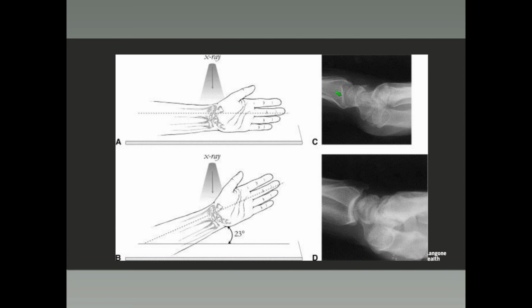Here's a good lateral x-ray, okay? But what you cannot see is down the joint line. Here, the ulna is obscuring the radial joint line. Not only that, remember, there is a 20-degree inclination to the radius. In order for us to see down the radius, down the joint, we have to lift the ulna and the radius about 20 degrees. Now we can very clearly see across the radiocarpal joint, and we want to look and see if our screws are below this.